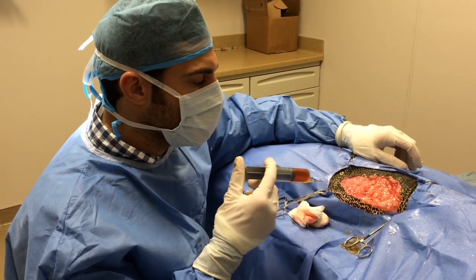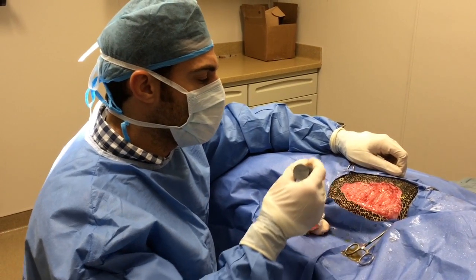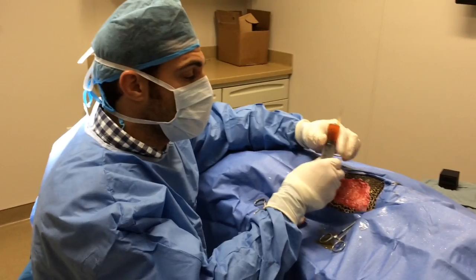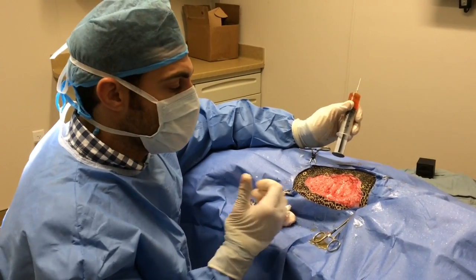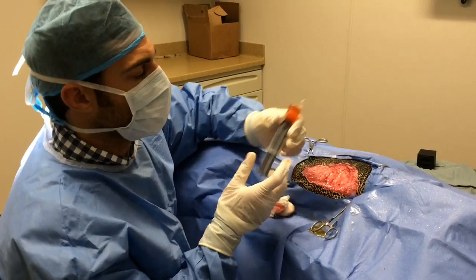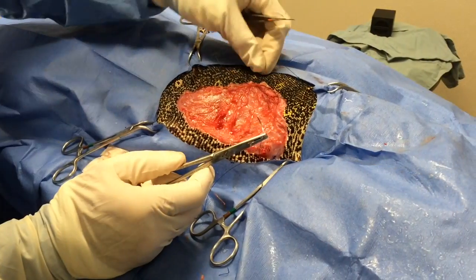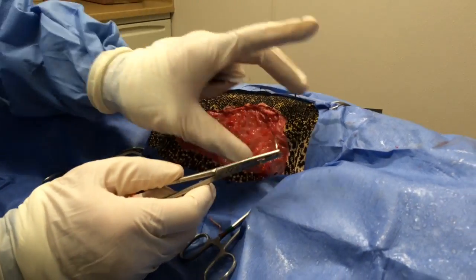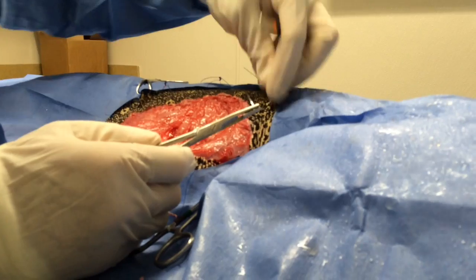Luckily we don't have to do that. So what we're going to do is called a tie-over bandage. That means putting a bunch of little loops all around the skin here. We'll be able to put gauze and bandaging across it and then tie it over like shoelaces, and just change that out every one to two days. So we're just tying in some little loops here so we can put the bandage on top and tie it over — I'll show you that when we get to that part.